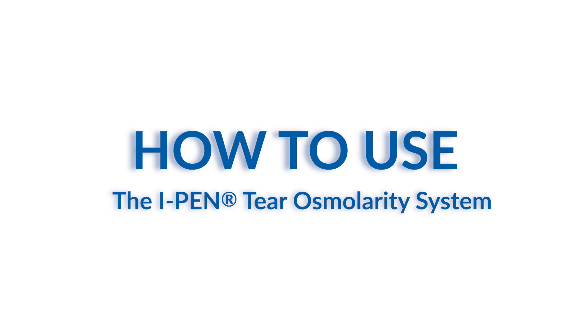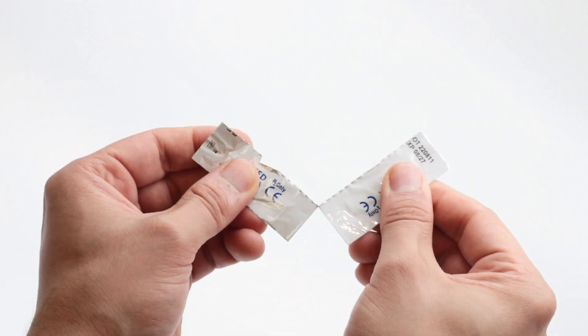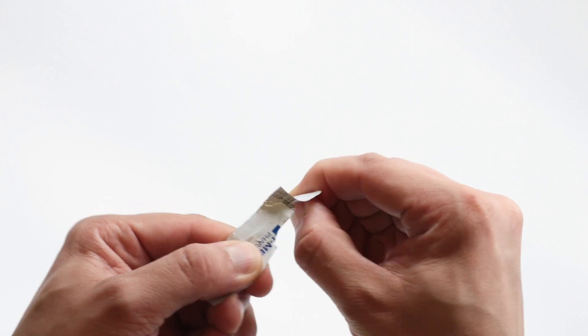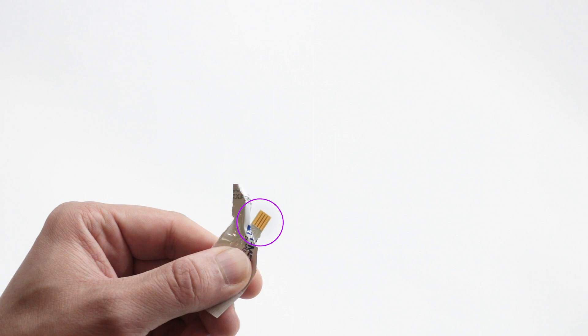Begin by removing one single-use sensor from its packaging. Tear along the dotted line to separate one of the attached wrapped sensors. Grasp the bottom of the packaged sensor firmly with one hand and carefully tear in the direction of the pre-cut section to expose the end of the sensor to be inserted into the eye pen device.